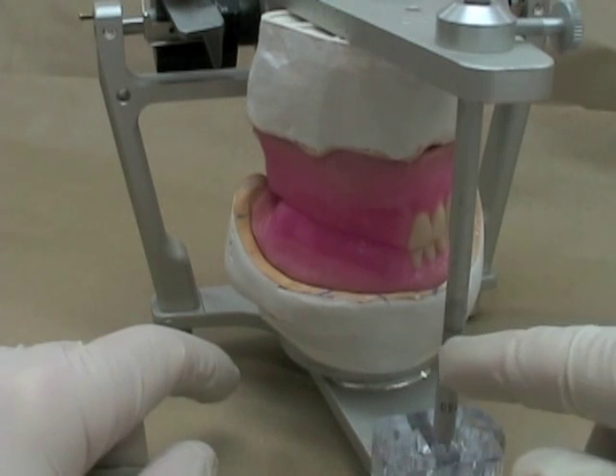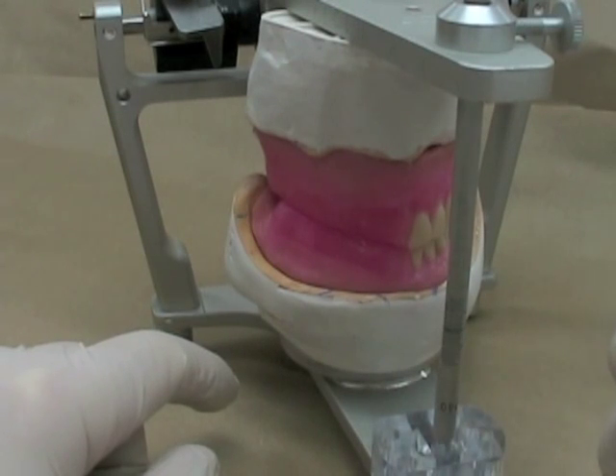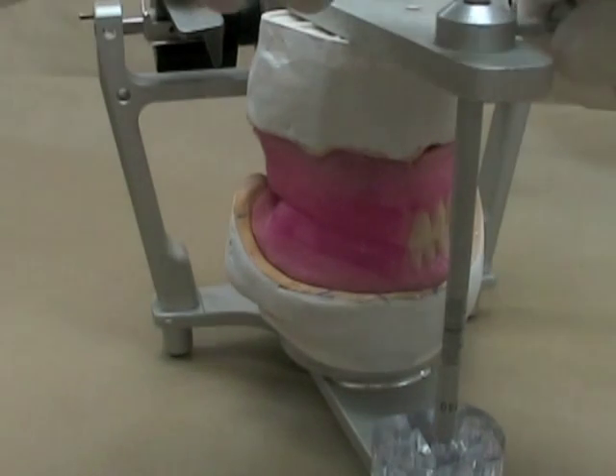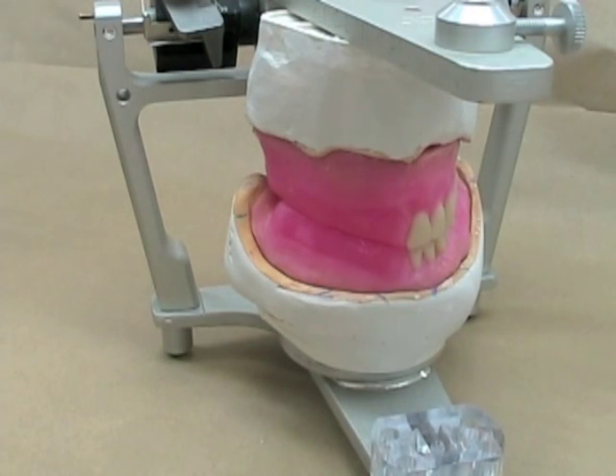The other thing to note is that you should always keep your incisal pin seated against the incisal table. But for this video, so that you can see a little bit easier, I'm going to remove that.